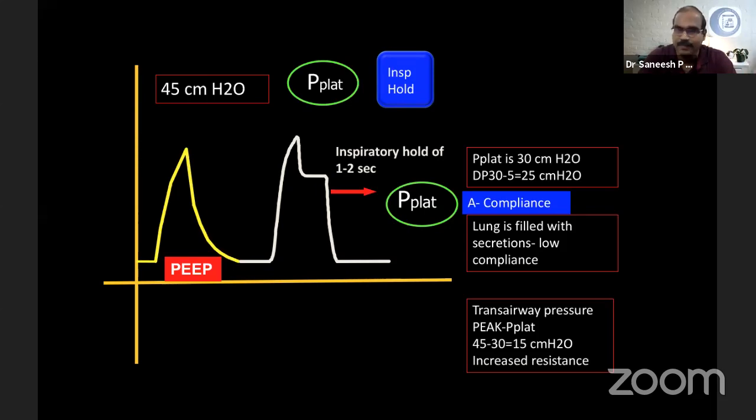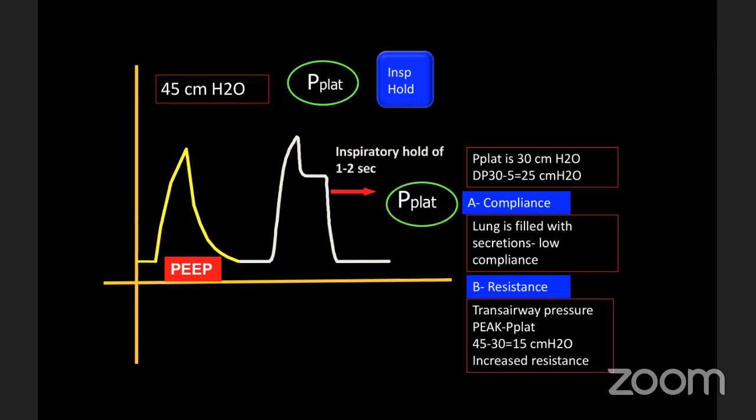It's not like you set it, forget about it and do the rounds next day. In critical care, it's always better to sit with the patient, see all the hemodynamic changes, watch all the changes in the ventilator, either graphic-wise or numerical-wise, and then according to the trend, you take decisions. So are you getting the point? Yes, sir. I got it. Thank you. Okay, fine.